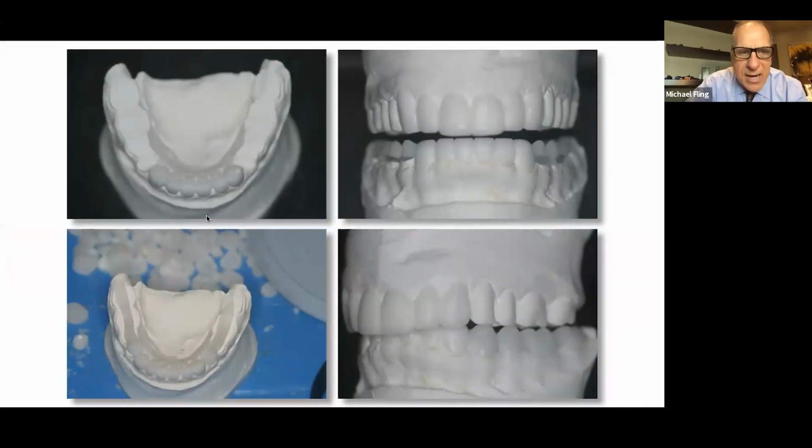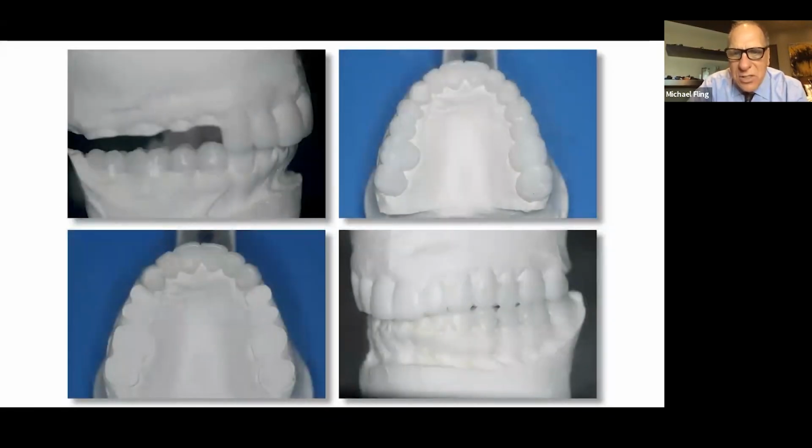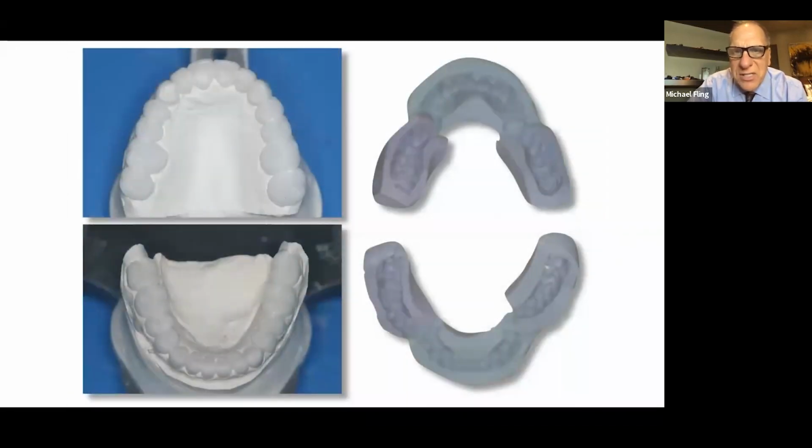And again, here you see my little teeth. Notice I've just taken away the back, gotten rid of all of the plaster, get it out of the way, set my teeth on here, and very quickly I can wax the posterior part of this. I get this occlusal plane how I want it. Now I'm going to cut down the plaster on the upper posterior, and I'm simply going to add teeth back there to mate against the lower posterior. And here you see me doing that. And now I have my stents.